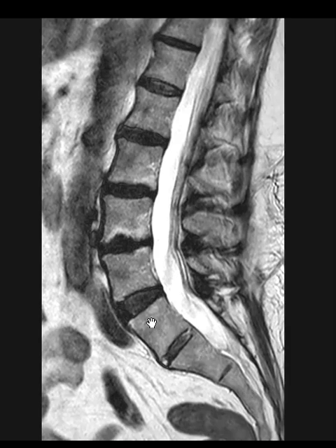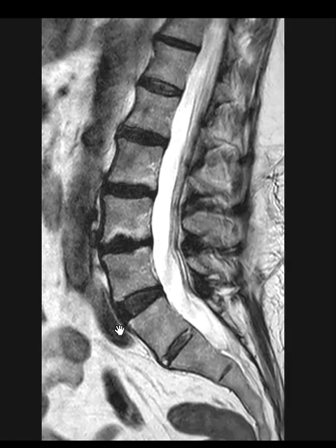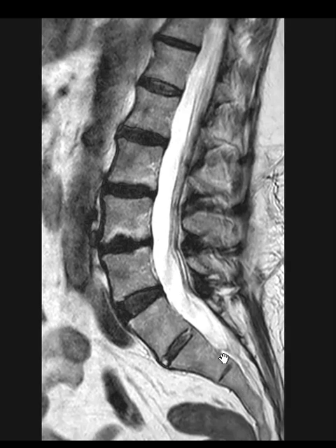This may be the sacral segment S1 and the lumbar spine is here, or possibly the lumbar spine comes down here and this is the bottom lumbar vertebral body and this is where the sacrum begins. But it's really hard to tell because this patient has what we call a transitional vertebral body. It's not quite a lumbar vertebral body shape. It's not quite the sacral shape.